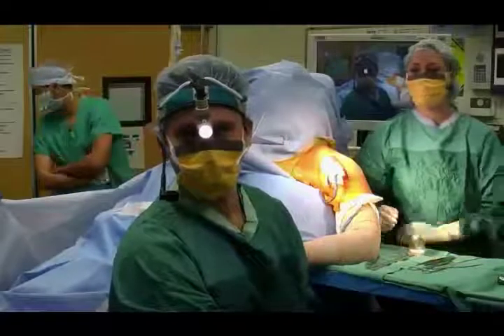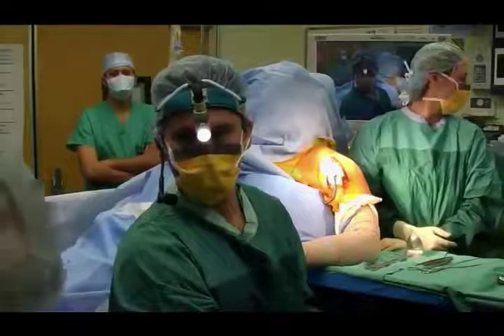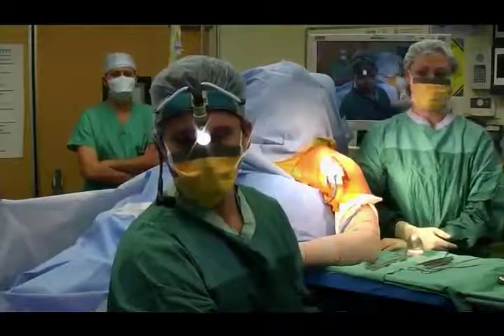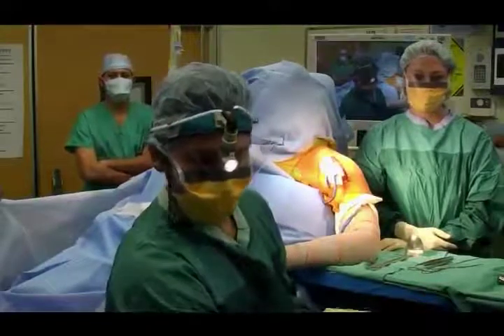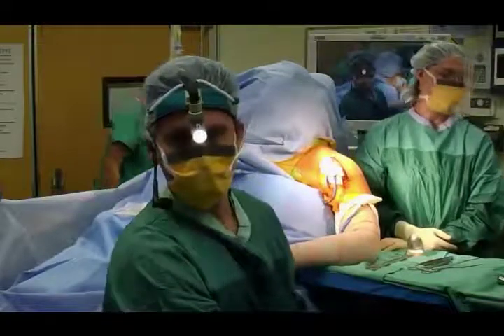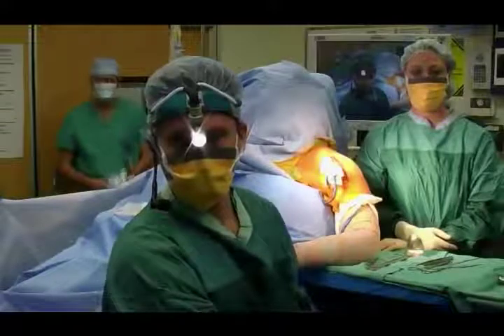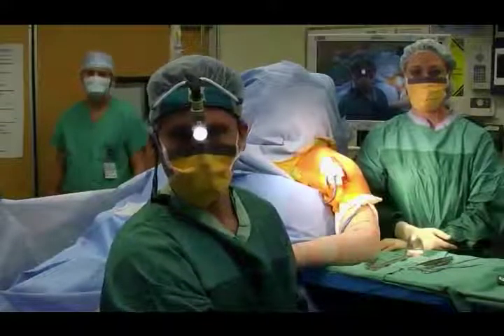Good morning. This is our live surgery demonstration. John Levy in South Florida is going to perform a reverse shoulder arthroplasty on a patient with rotator cuff arthropathy and high-riding humeral head. He'll discuss his strategy. Good morning.